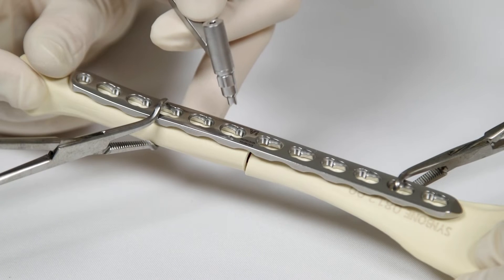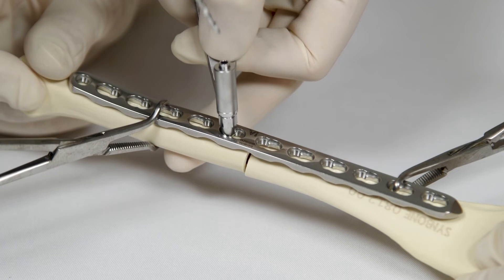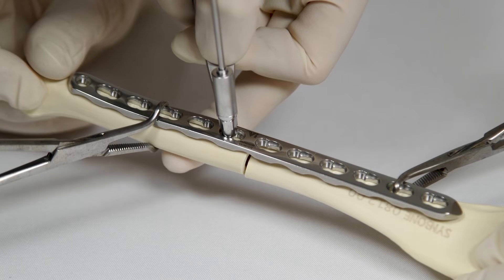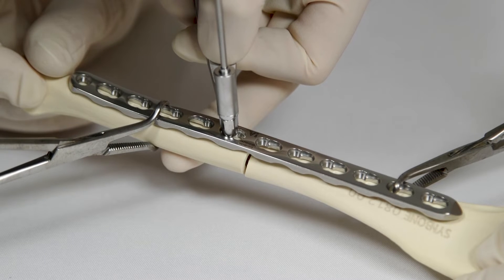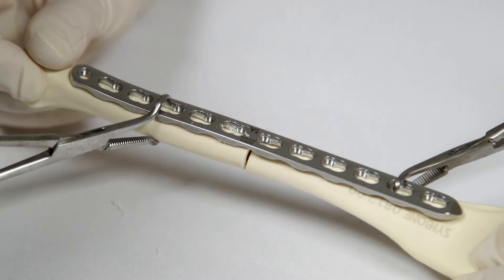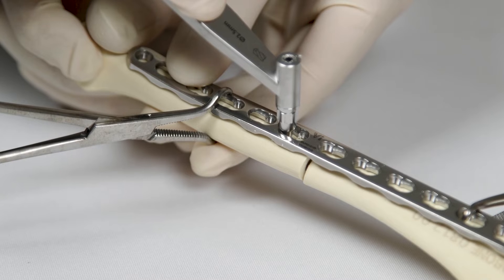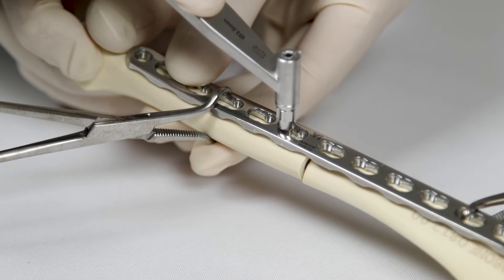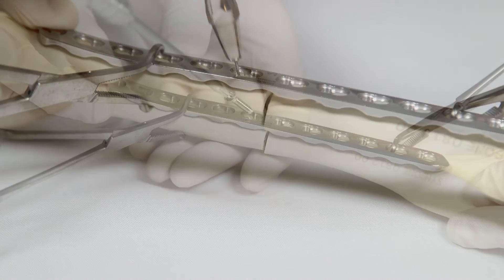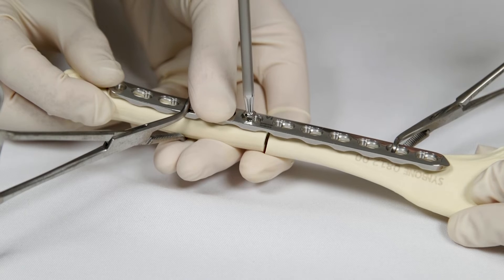The first screw placed when using a DLP in compression mode is a non-locking cortical screw in the neutral position. This is placed in the oval end of the plate hole nearest the fracture on one side. Neutral pilot hole placement is achieved by pressing down on the spring-loaded tip of the universal drill guide. The depth of the hole is measured and the screw inserted in the usual way. This screw secures the plate to the bone.